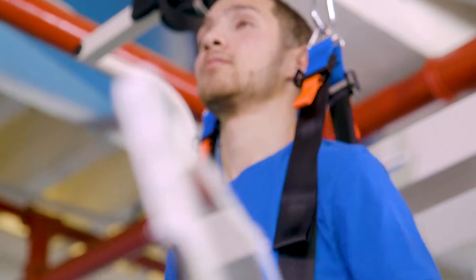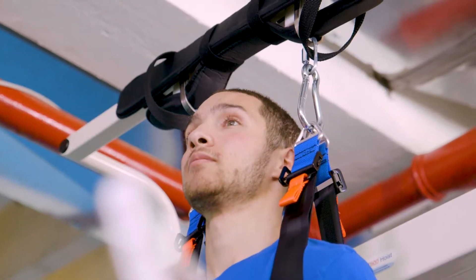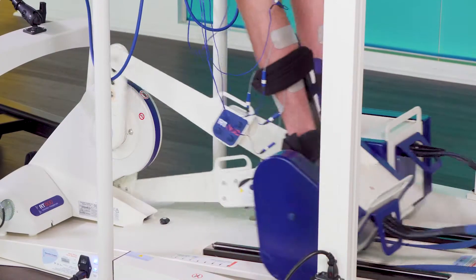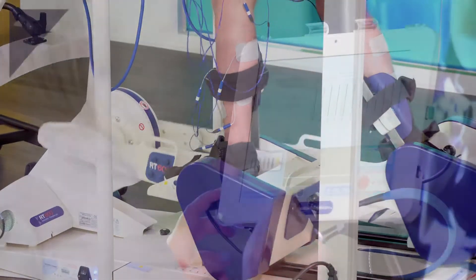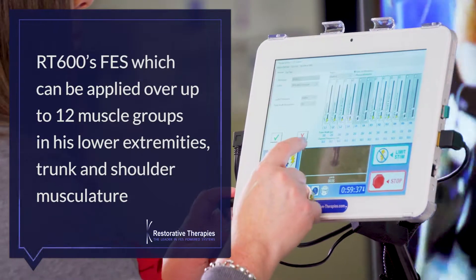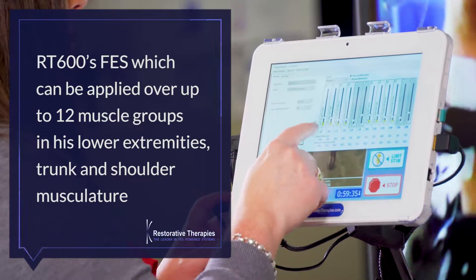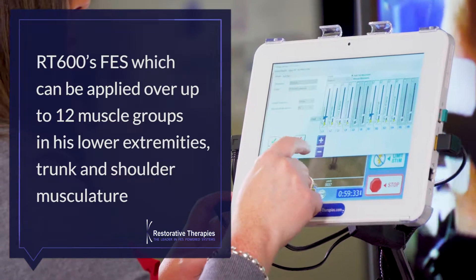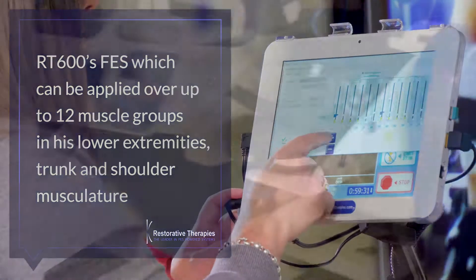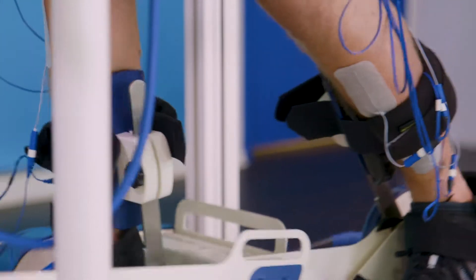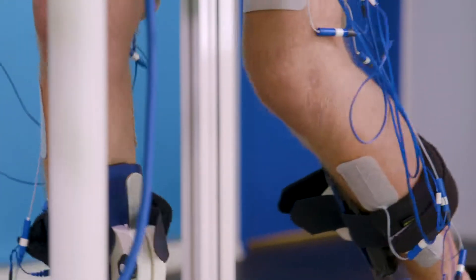The goal of RT600 therapy is for Parker to step using his own muscles while bearing his own body weight. Parker's ability to step and bear his weight is facilitated or enhanced by the RT600's FES, which can be applied over up to 12 muscle groups in his lower extremities, trunk, and shoulder musculature. The FES is timed appropriately with the stepping motion, providing muscle activation and sensory cueing in a walking pattern.